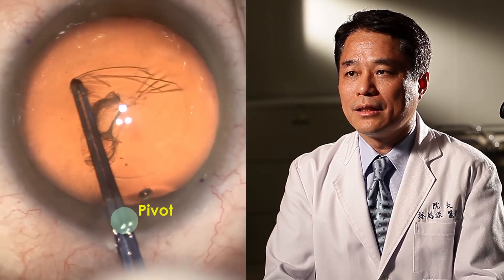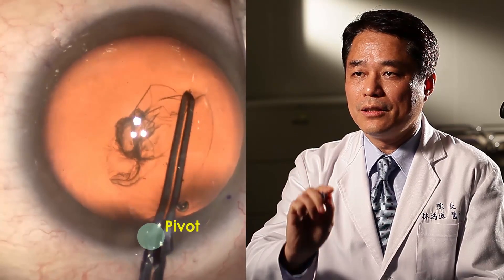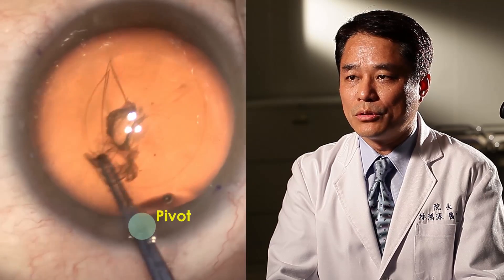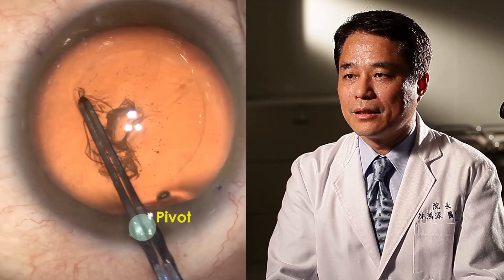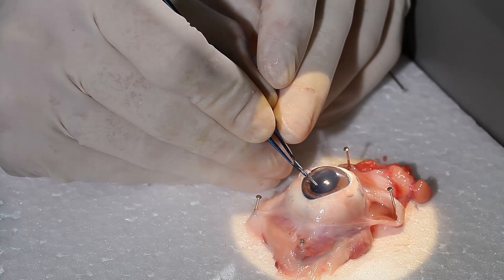The capsular forceps should be centered on a fixed pivot point to allow for a wide range of movement inside the eye, without rotating the eyeball and causing distortion of the cornea. Practice makes perfect. We can master this pivoting technique with artificial eye models or porcine eyes.